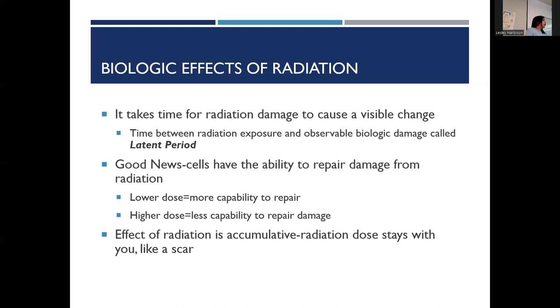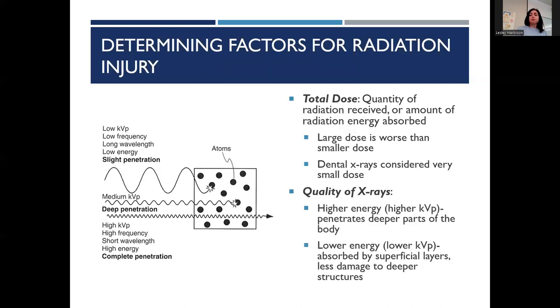And then you do your risk assessment and you say, really, let's look in their mouth and maybe they are fine. Maybe we can put it off. They just had a ton of radiation. Maybe we can put it off a year. Or maybe we can take bitewings and one PA of this one area that we were concerned about. You can work with patients around certain things, especially if they are really concerned about their accumulative effect or amount of radiation.